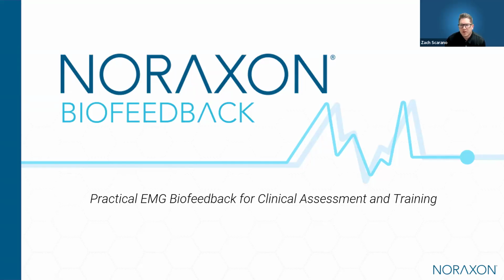Okay. Well, hello, everyone, and thank you for joining us today. I am Zach Scarano, the Director of Product and Software here at Noraxon. And today we'll be introducing the Noraxon Biofeedback App, a mobile-first solution designed to bring EMG biofeedback into everyday clinical workflows. And so before we jump into the demonstration, I want to just briefly frame why EMG biofeedback is such a valuable tool in clinical practice.